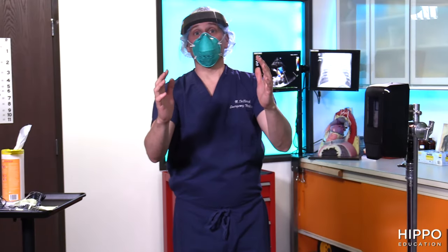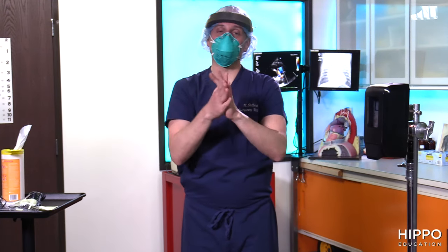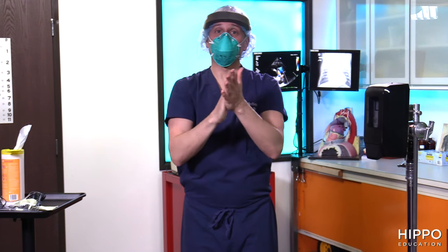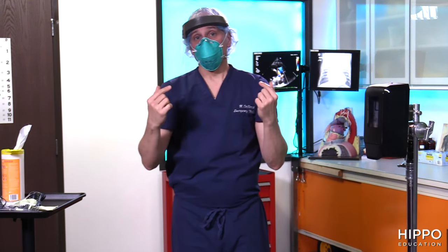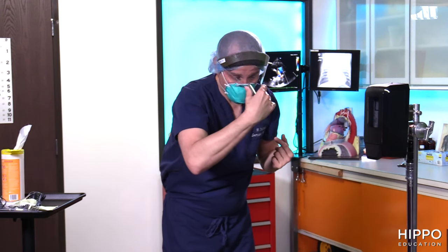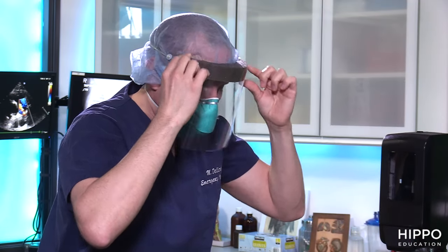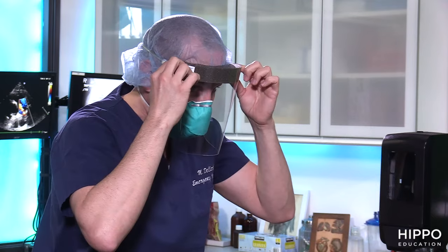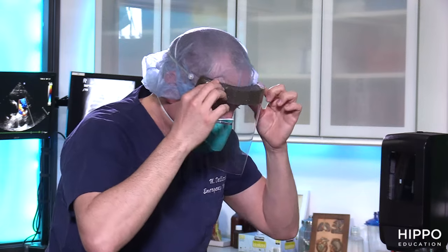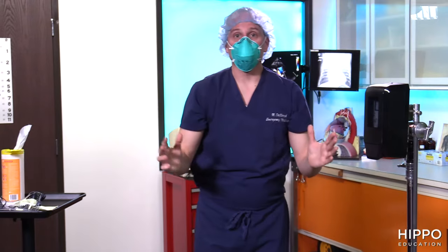At this point, repeat hand hygiene. Then remove the face shield. You can grab the front of the mask and pull off, or grab from the sides and pull back — avoid going behind your head to prevent contaminating your hair. Remove it away from you and throw it in the trash. Then do hand hygiene again, because every time you remove something, there's risk of contamination.